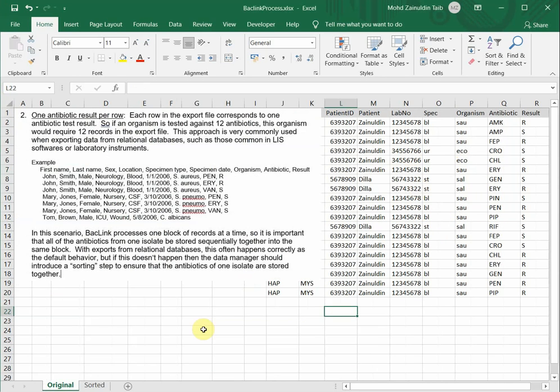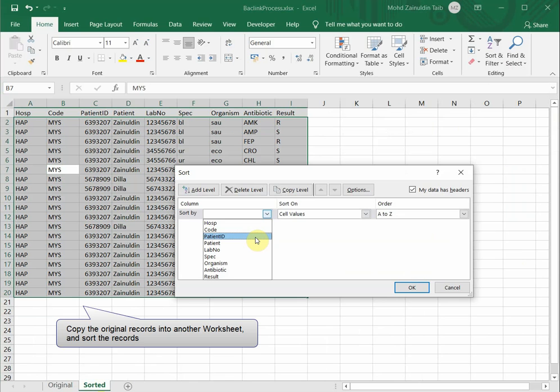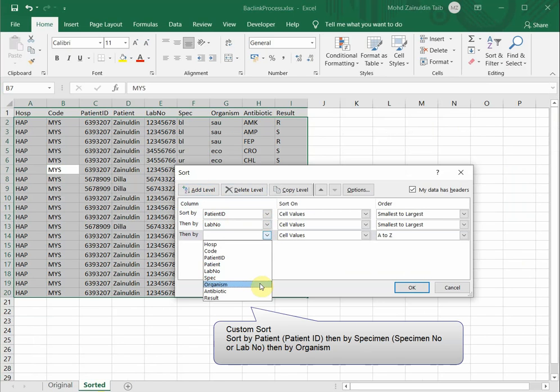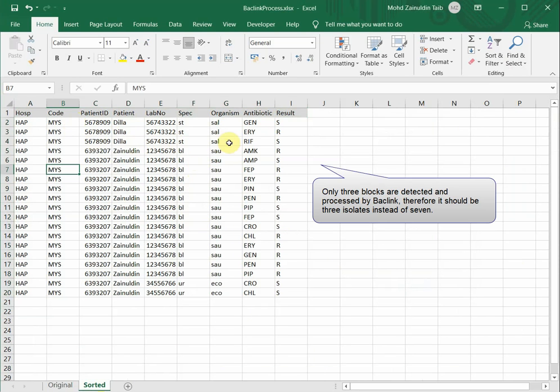How to get these into the same block? We go for custom sort, first with the patient ID. Next, at the label, one patient might have more than one specimen, so we go by specimen number or lab number. And another label, we go by organisms. Click OK, it is sorted. You can see here, it's considered one block, one isolate, and all these blood and aureus another block, the isolate, urine and E. coli another isolate. So it's only 3 isolates here instead of 7 isolates.